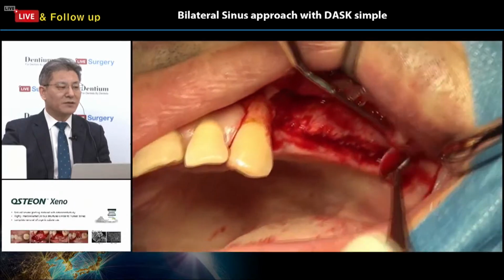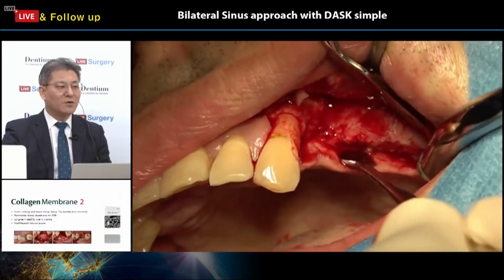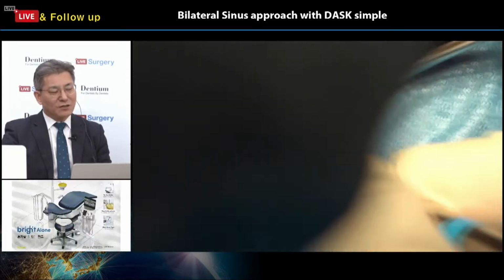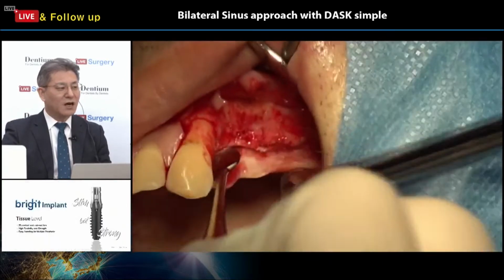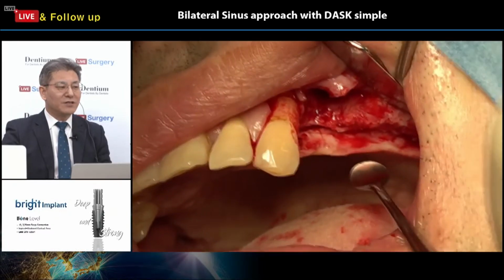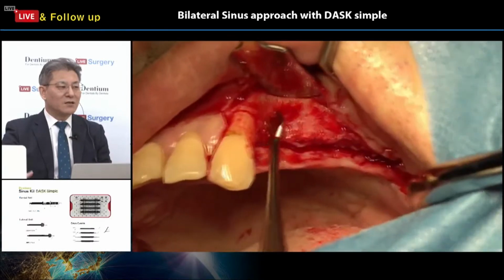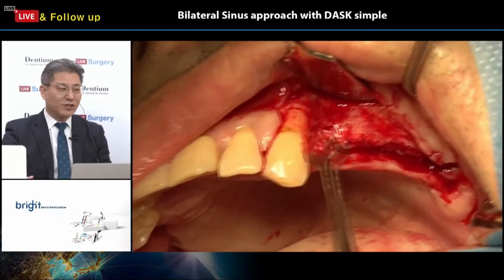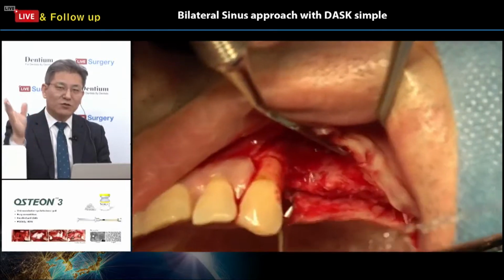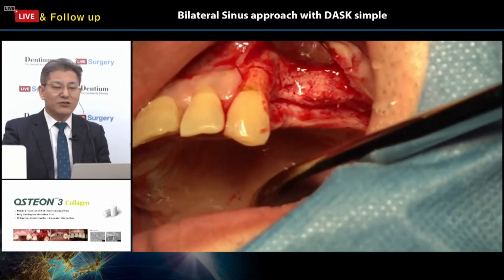As I mentioned before, the number 24 area has an exposed bone defect. I think the alveolar ridge is almost 2 to 3 millimeters, so very thin. So how can I approach this sort of situation? A very thin ridge and a 2-wall defect. So how can I deal with this kind of situation?